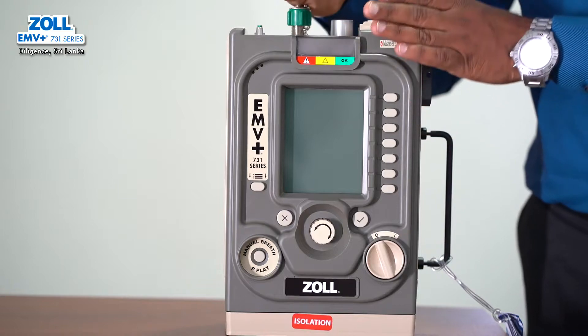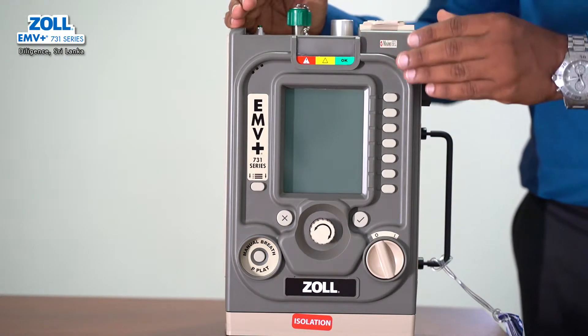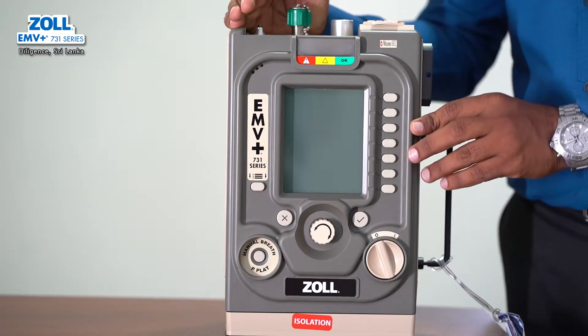The infant pediatric circuit is used for patients from 5 kg to 30 kg. The adult pediatric circuit is used for patients from 20 kg and above. If you have a child under 18 kg, you can use the infant circuit.